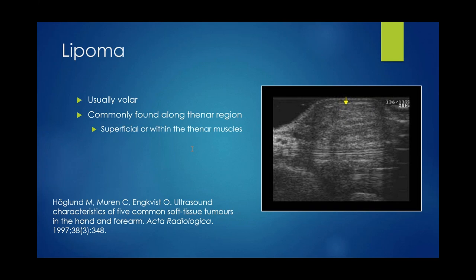Next question: what's your ultrasound injection technique for scapholunate OA, transducer plane, needle size, gauge, etc.? That was one of my first couple of slides, where I was talking about the dorsal recess. Typically, I would approach either the radiocarpal joint or the midcarpal joint in plane with the transducer and along the long axis of the hand. So I would align the transducer with my target joint, traditionally directly underneath the transducer, and then find a window where I could put the needle in that region without going through a tendon, preferably, and then down into whichever recess I'm targeting.